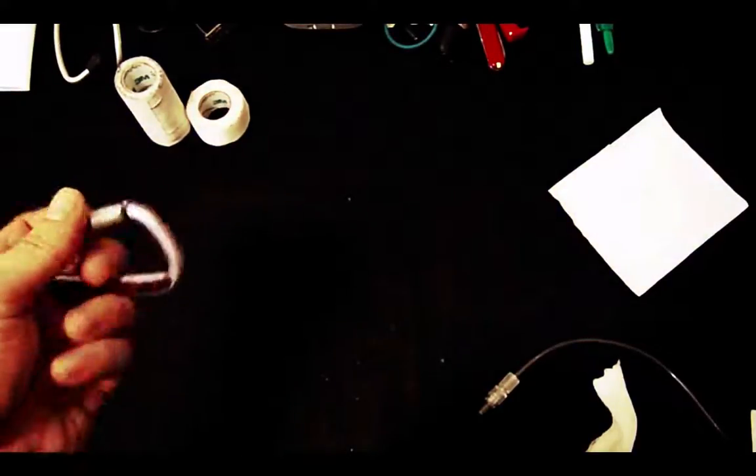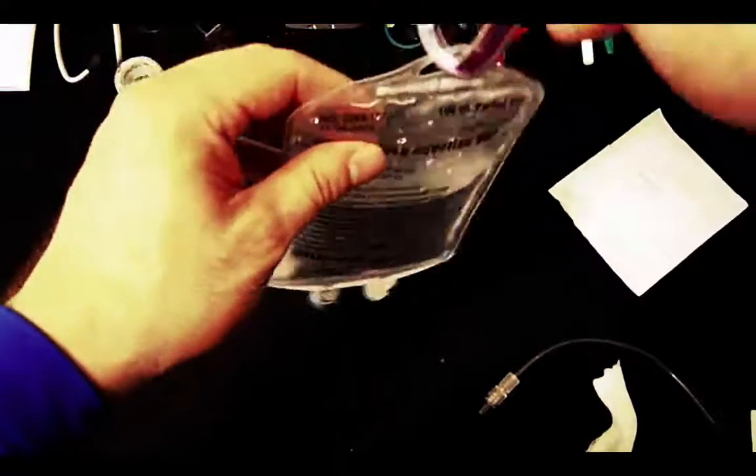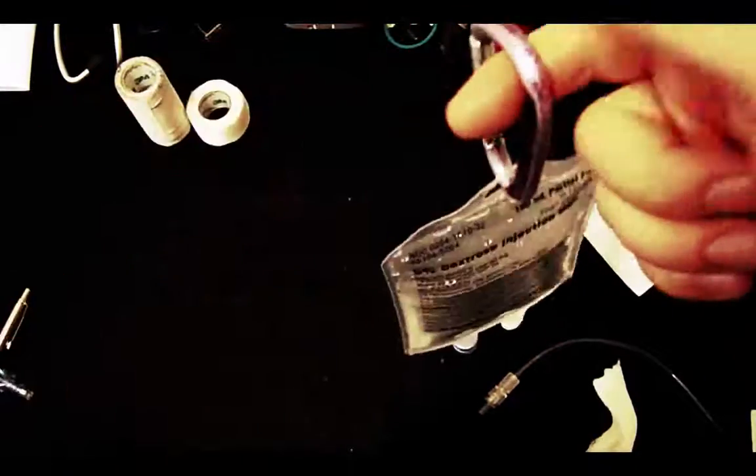You always want to have tape with you — to label your lines, label your syringes, and secure things. I always have thicker pieces as well if I need to secure an IV pump to the stretcher. I also like to carry a carabiner — you can hook it to the back of your stretcher and hang IV bags from it. If you have multiple drips going at the same time, you can hang them on the back of the stretcher until you get into the ambulance.